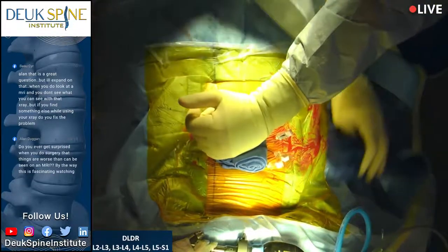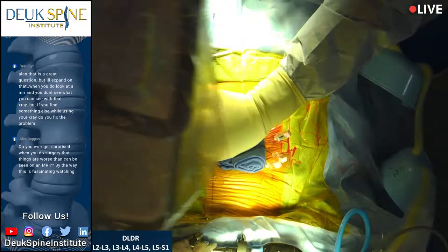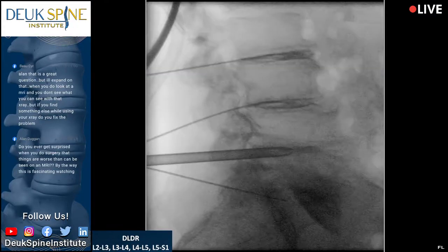That's L4-5 we're done with. Luis, what are we doing next? 3-4. We're in at 5-1. What are you afraid of? My tubes. I see what you're afraid of. Let's go lateral. So today, my assistant, Luis, gets to pick the order that we're fixing these discs.